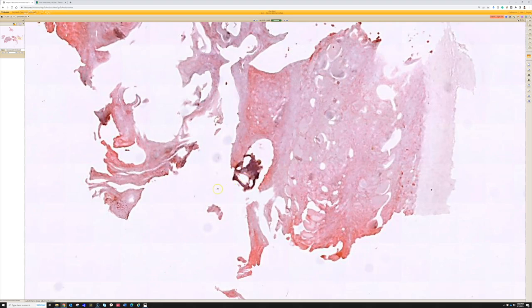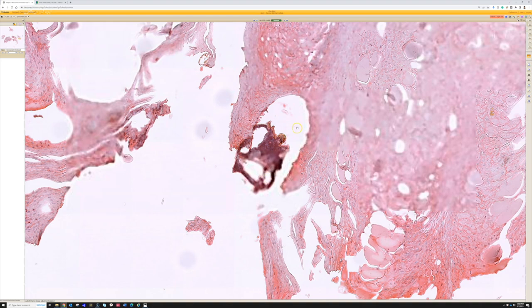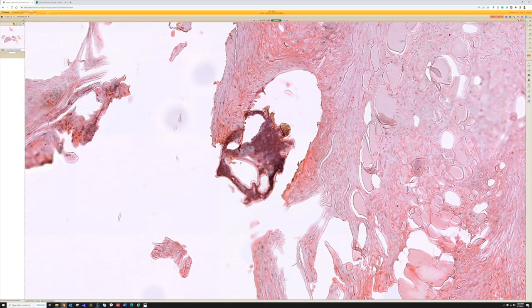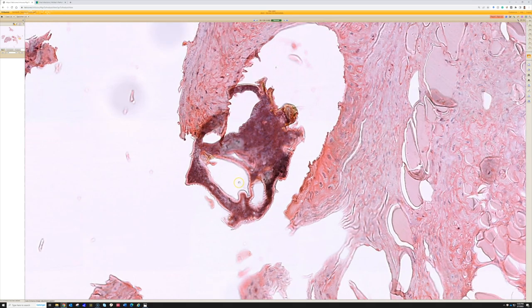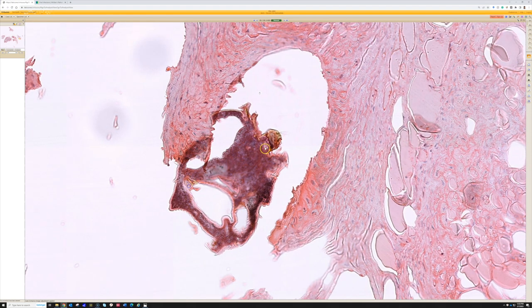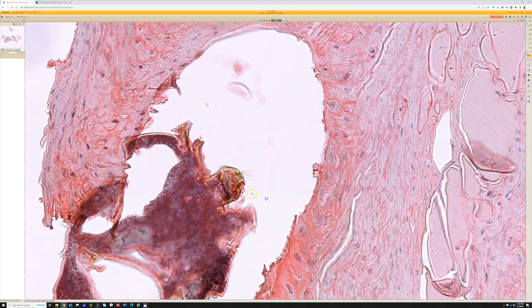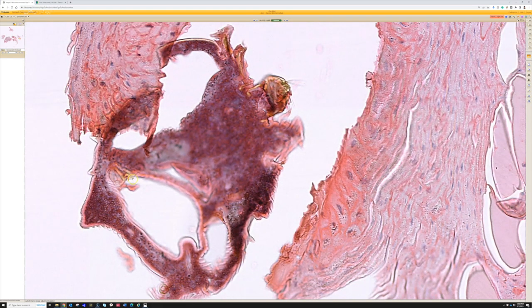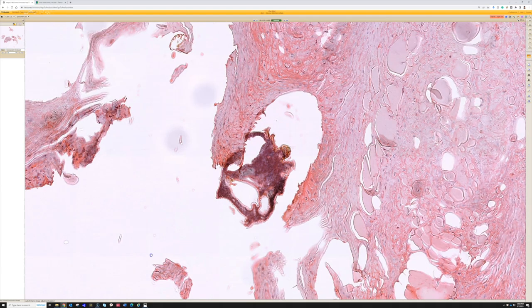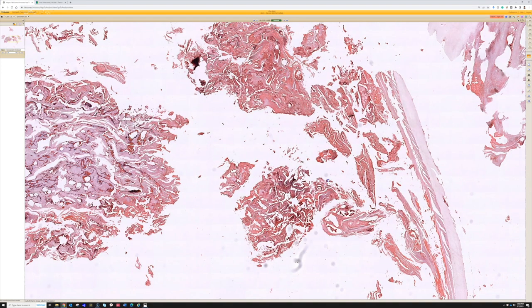I don't think I've actually seen a real case of subungual scabies in practice, but it is out there — be on the lookout for it. The mite is visible here in its burrow, showing the same findings as regular or crusted scabies of the skin, just underneath the nail plate. The exoskeleton has areas of yellow chitin, typical of scabies, ticks, and other arthropods. So this is an adult scabies mite with pigtail eggshell remnants and individual eggs, all with abundant parakeratosis underneath the nail plate — subungual crusted scabies.